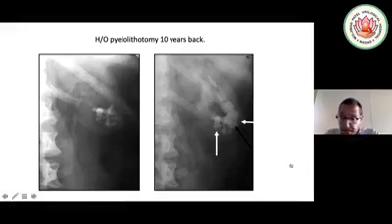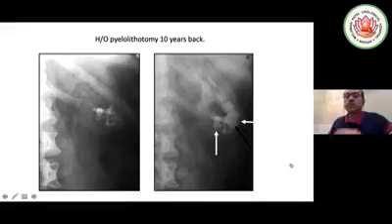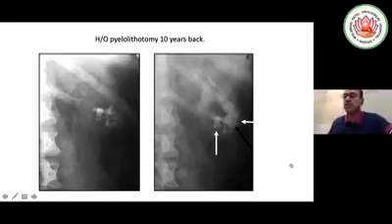All right. So coming to the question, Aditya, I'll come to you, because I want to ask you also the questions. First, the question to Guido, when you showed in your demonstration that you move the C-arm to cranial and caudal. Now, do you move the C-arm how we do in a prone position, side to side, or is it always cranial and caudal?